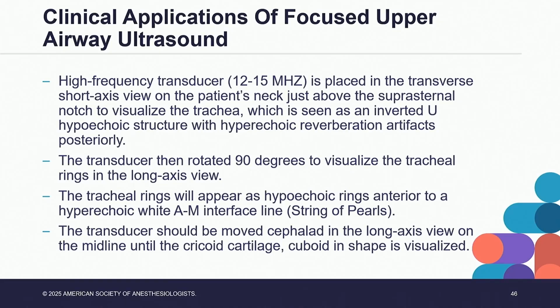You can pierce that, so you can use it for cricothyroidotomy or recurrent laryngeal nerve block.